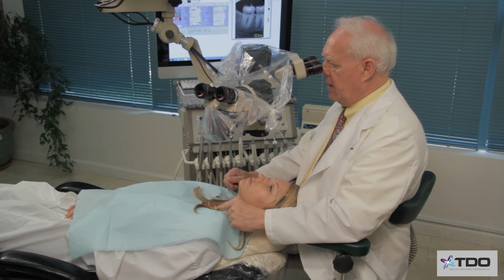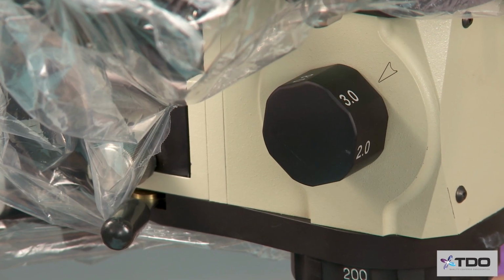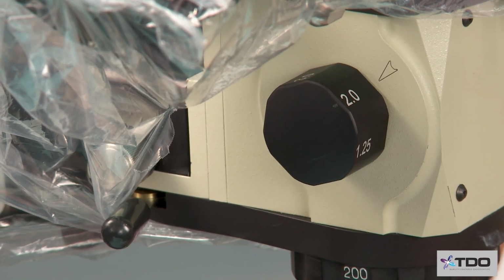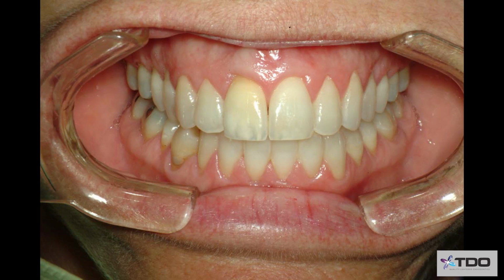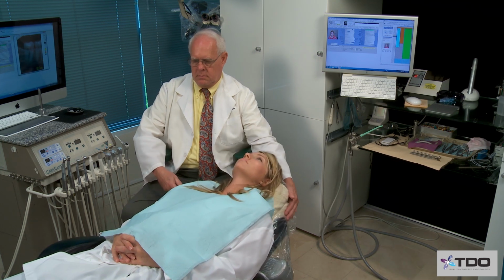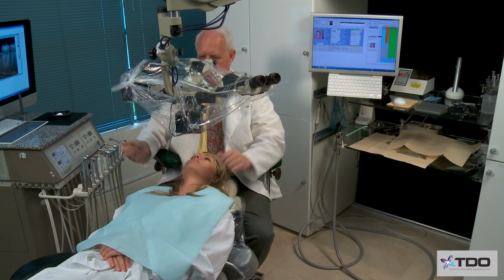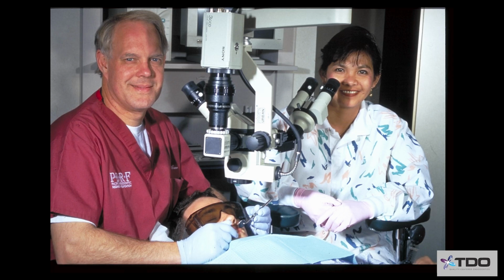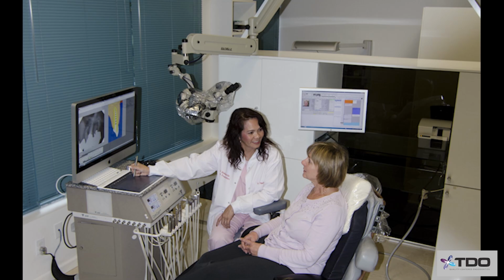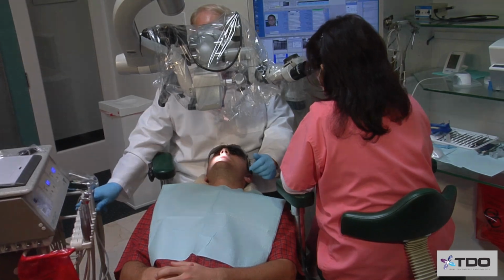Number one, a 6-step microscope that goes down to 2.2 magnification, allowing you to see the entire mandibular and maxillary quadrant at the lowest power. 2, a floating chair, one that is easily movable with the legs. 3, proper doctor stools with armrests. 4, assistant at the scope. 5, an ergonomic office design. And 6, an easily movable cart.